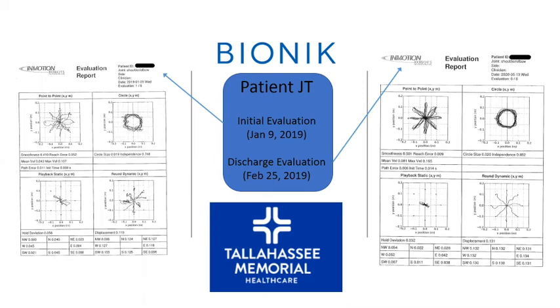And Sue, I want to tell you, you have the perfect video for this. In your video, it literally shows exactly how to do this. You put your patient on the device, you warm them up, and this acts as your therapeutic exercise or your neuro-re-ed techniques. And you can get hands-on with the patient while you're working with them. The device does not interfere with that.